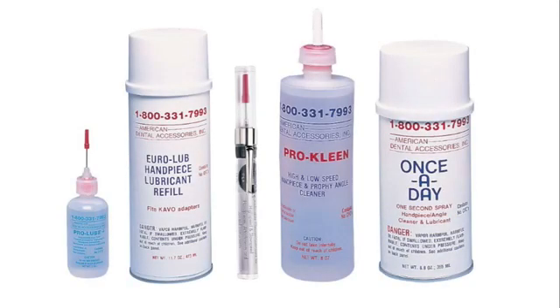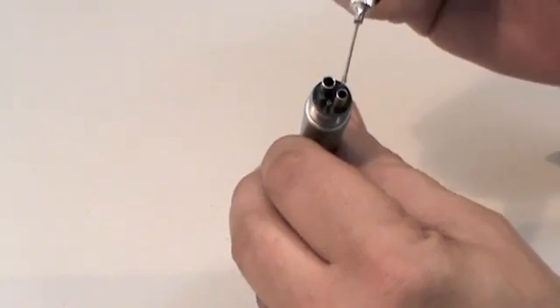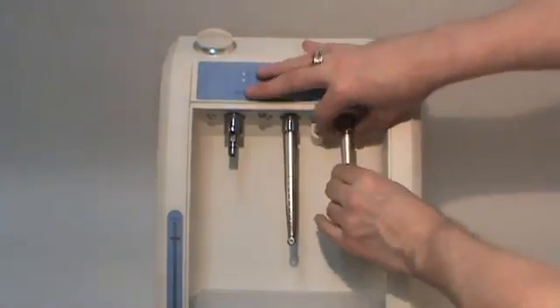American Dental Accessories recommends cleaning and lubricating the handpiece before each autoclave cycle, and we offer several lubricants and cleaners specifically approved for this operation. Handpiece lubricants and cleaners are only sprayed or dropped into the drive air hole of a handpiece. The exhaust hole does not connect to the turbine. Flush or purge your handpiece after every lubrication and before sterilizing.